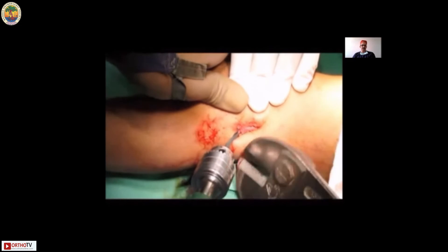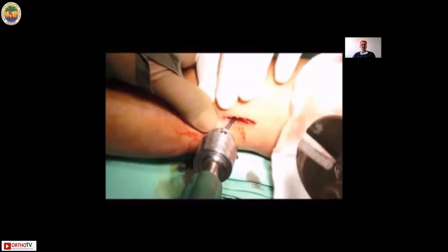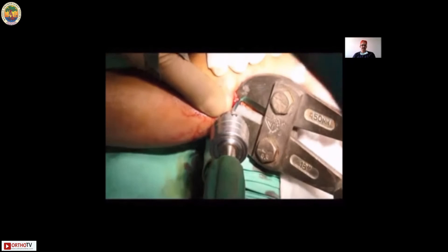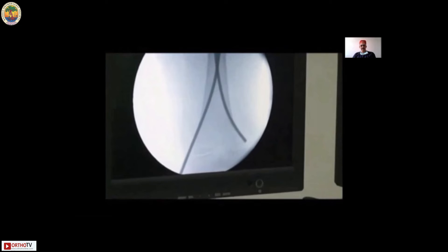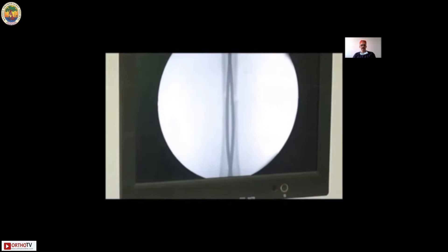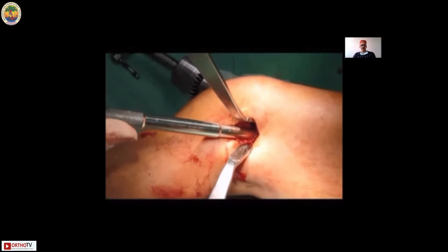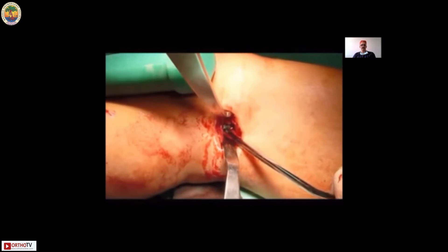Once you know the seating points, withdraw the nail about a centimeter so that you can cut it. Use a big Harrington rod cutter or a special tool to cut the nail such that about an inch remains outside, flush with the lateral cortex. It's important to do this step correctly — this is not a K-wire which needs to be bent at right angles and left outside, as that causes irritation of ligaments and synovium leading to a stiff knee. Make sure it goes under the muscle. There is a special seating tool: it has a bevel on one side and a small hollow — tap it so that it reaches the cortex.